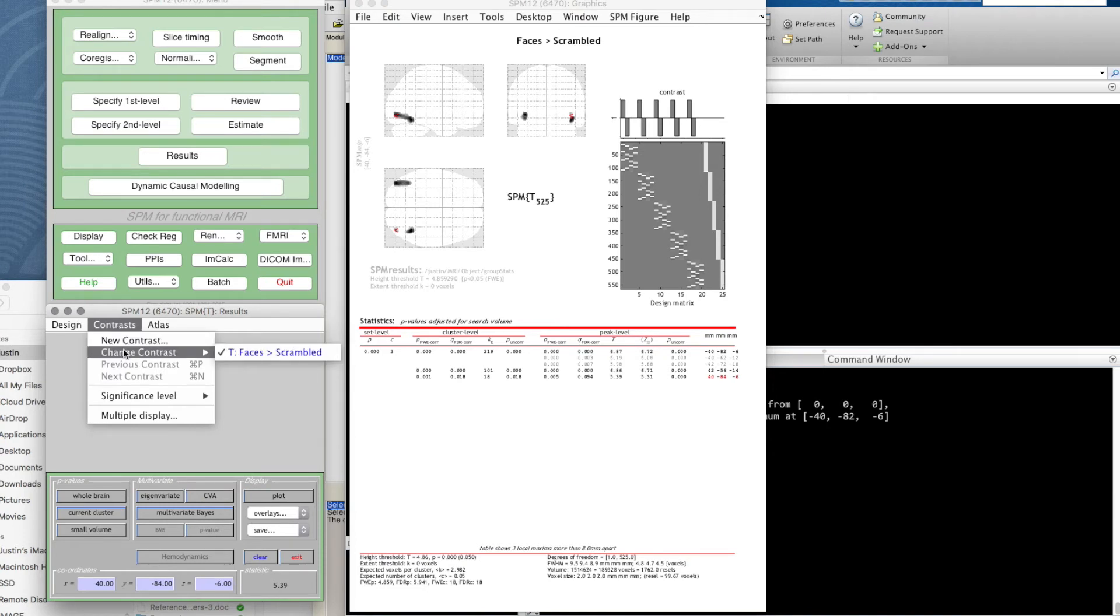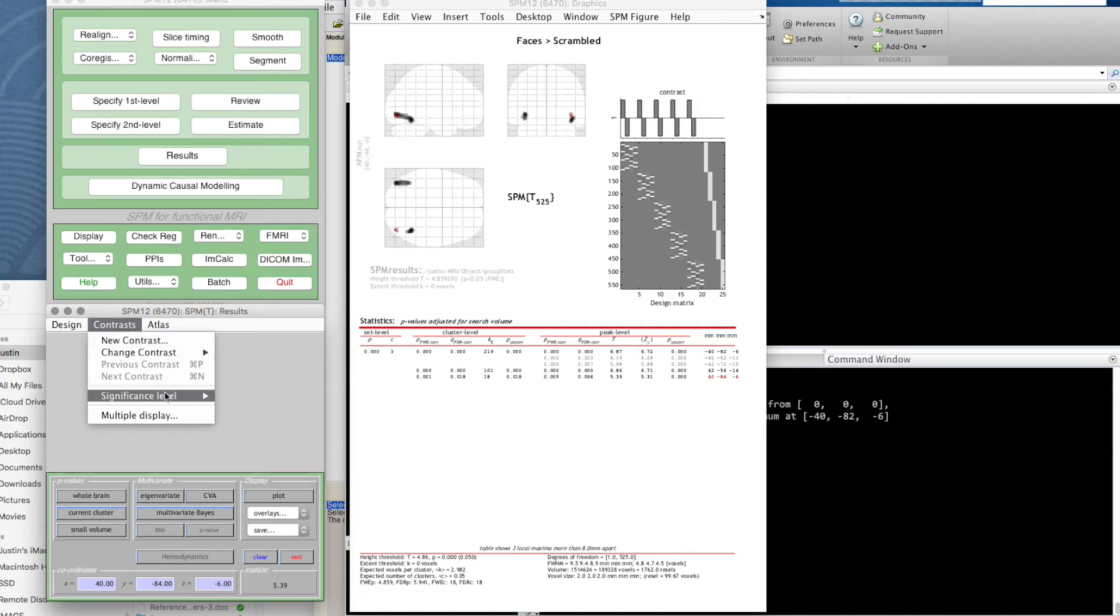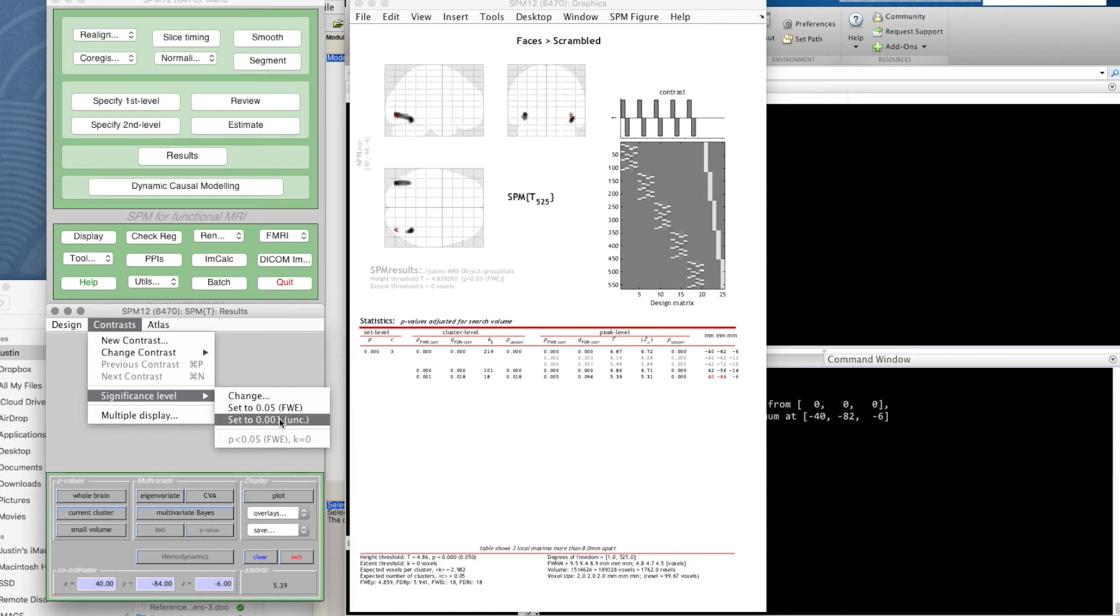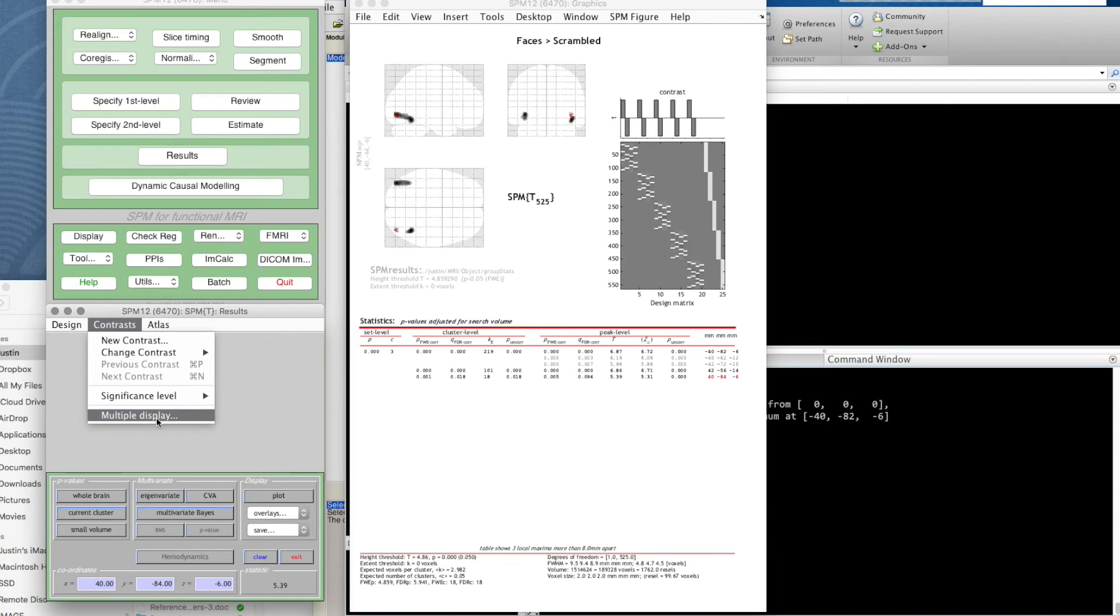For contrasts, we can change to different contrasts, which we don't have—we've only defined one so far—or create/define a new contrast, which we will do soon. We can change our significance level. You wouldn't often change it away from a corrected sensible threshold. Sometimes if there's a problem with data and it looks very messy, you change the threshold to something uncorrected just to see if when you change the threshold you get activation where you expect it, but you wouldn't normally do that.